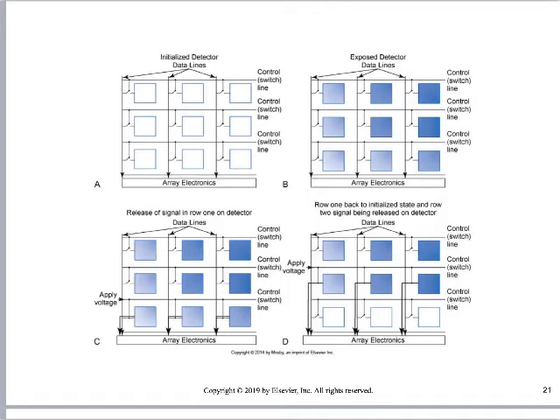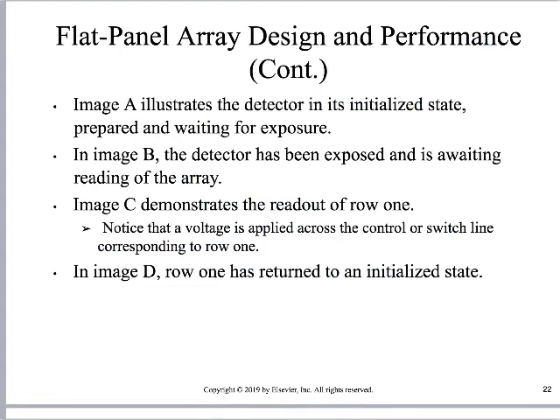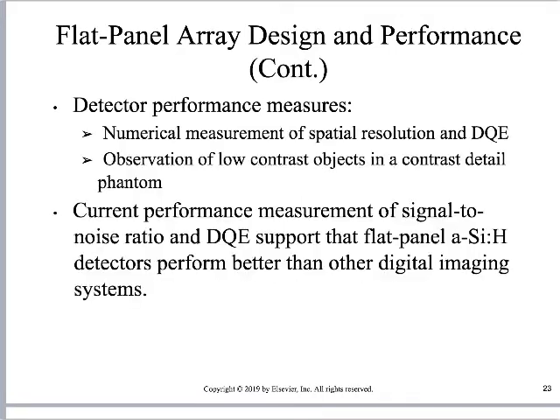So all of the stuff that looks like this, I'm saying you don't need to know, right? So here's an example of stuff you don't need to know about this. What you do need to know is how that affects performance of the system, right? The fact that it's read out line by line and that we've got tons and tons of electrical bias being processed by this, we need to know as X-ray techs, right?